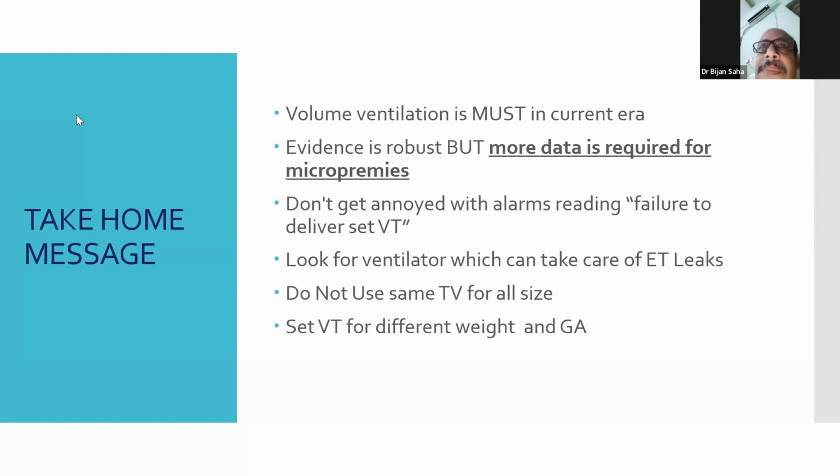Yes, Draeger 80% is very good. SLE also claim that they can compensate 60-70%. The principle is that when you talk about volume ventilation, at least leak compensation and leak adaptation have to be there. One needs to go into the detail, and if these are there, then only go for volume ventilation. Otherwise, it should be pressure ventilation. That is what my message would be.